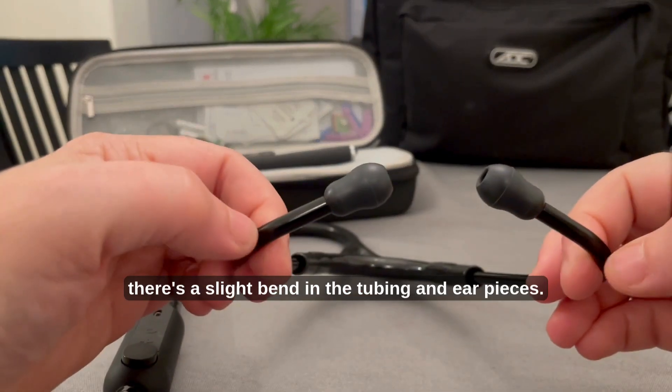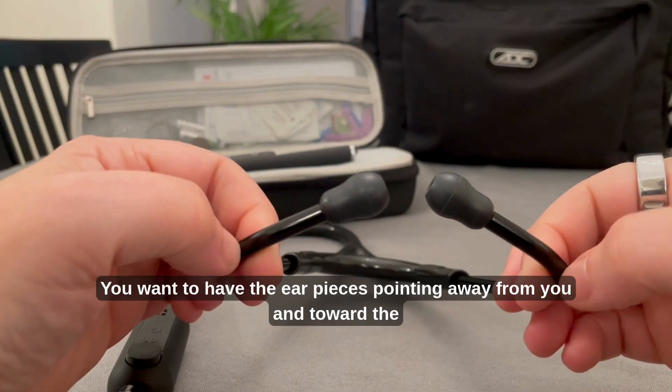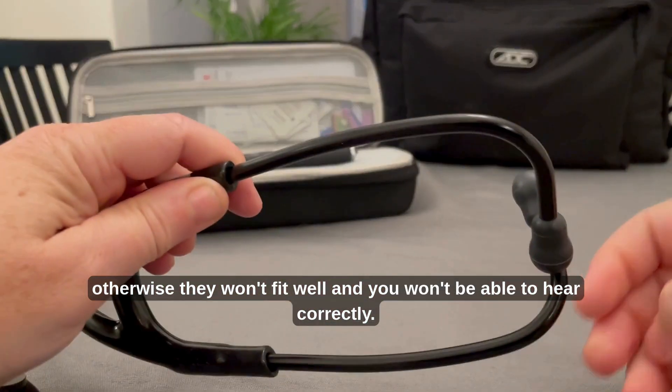Just like any other stethoscope, there is a slight bend in the tubing and ear pieces. You want to have the ear pieces pointing away from you and toward the patient, otherwise they won't fit well and you won't be able to hear correctly.